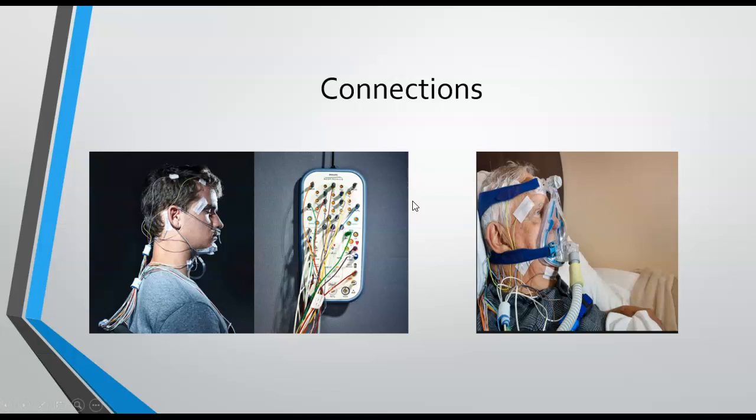So how do we do the sleep study? Now we need to connect exactly similar to the diagnostic PSG. We will connect the EEG, ECG, EMGs, EOGs, respiratory effort belts, etc. During the diagnostic study, you can see that there is a nasal oronasal pressure transducer or a thermistor, which is used to measure the flow of the air.